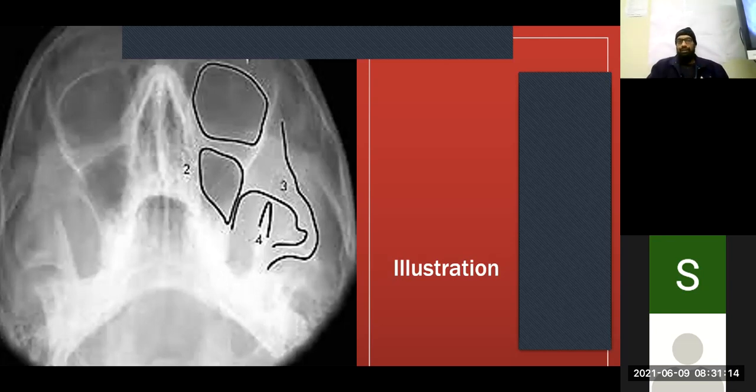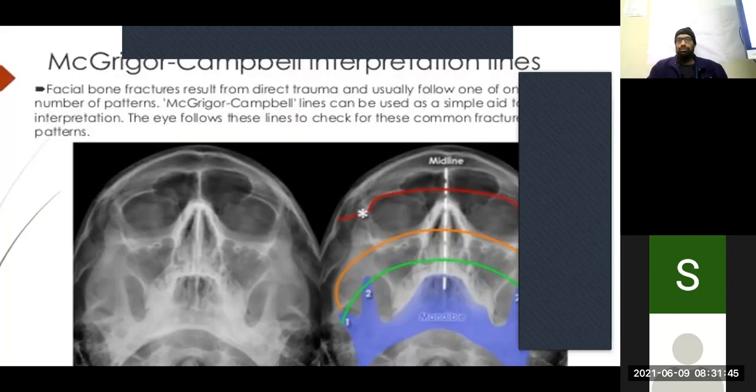The reason why I mentioned that is all of these X-rays that we're going to see today are beautiful X-rays. They are put in textbooks, they are published because they look so lovely, and you can see everything so beautifully. But we know what happens. 2 o'clock in the morning, the radiographers just had a nap, just got up, forgot how to position the patient. All of a sudden, they look at it, what the heck is an OM X-ray? I can't remember. Overexposed, underexposed. So in other words, it can become difficult to look at these things. So you need to be able to imagine what's supposed to be there, and then we'll talk about what you do towards that.